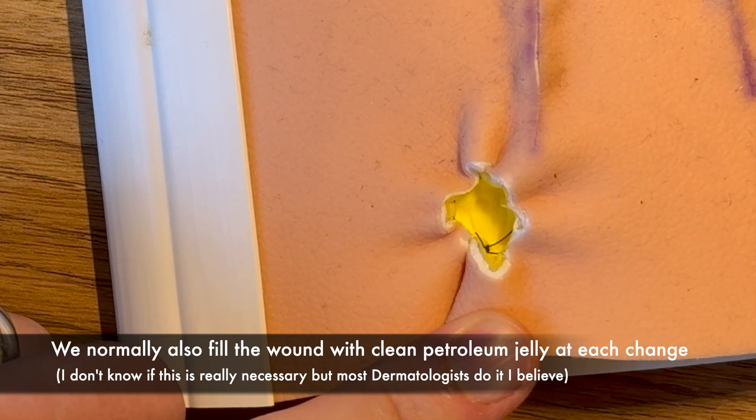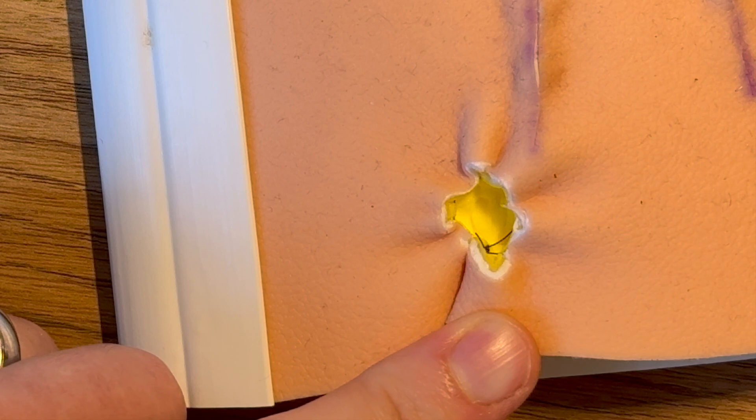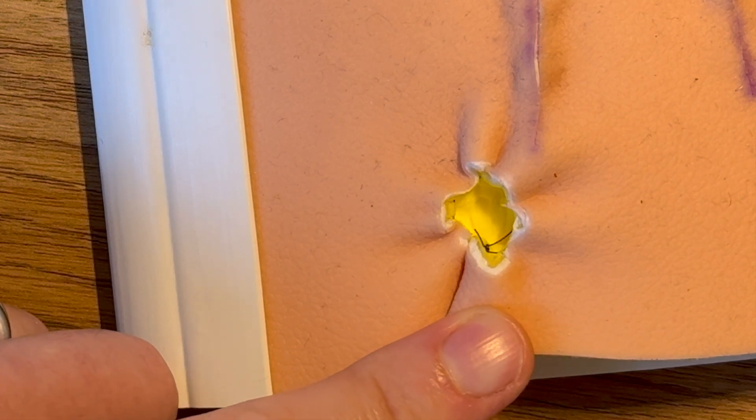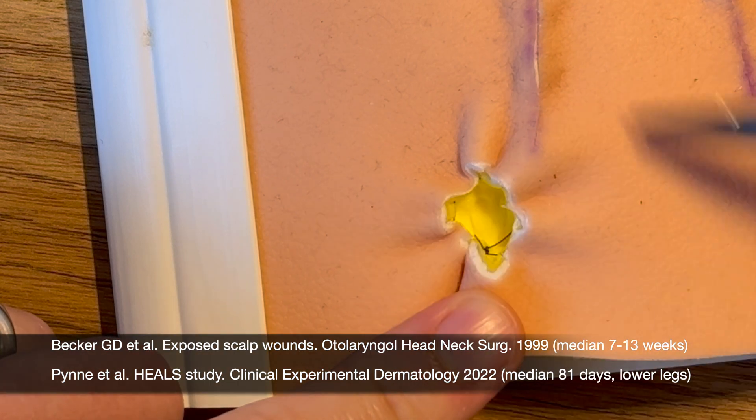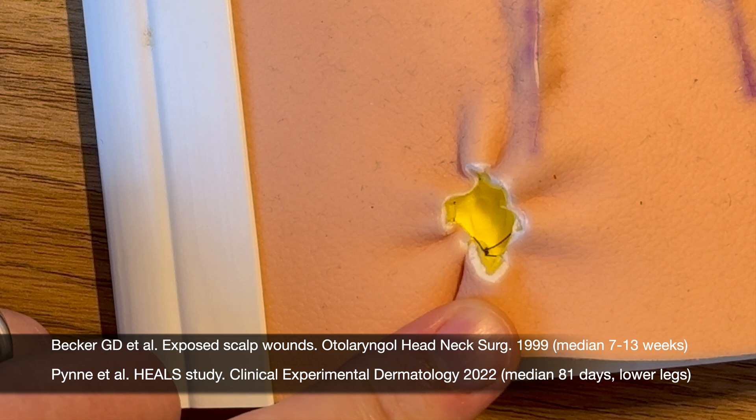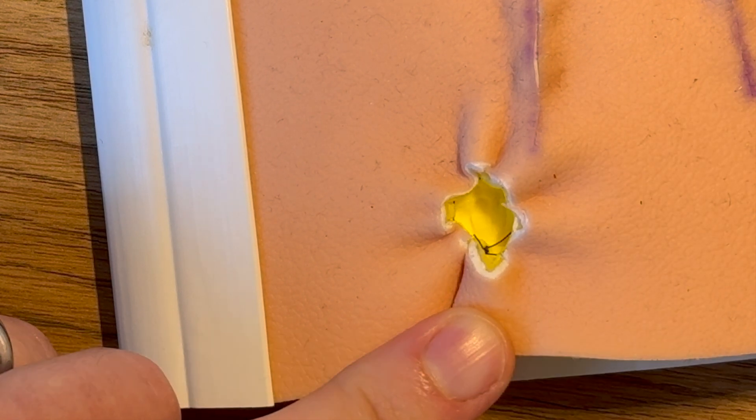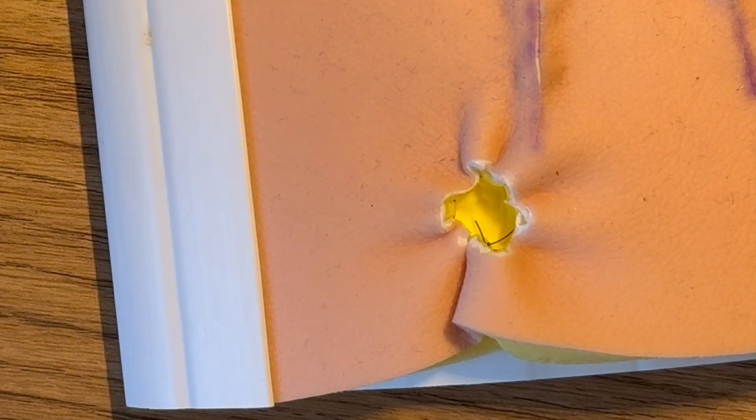And just keep doing that until it fills in which will depend on how big it is and the patient's general nutritional status. But it's likely to be a few weeks for something like that, sometimes a few months if you're unlucky.